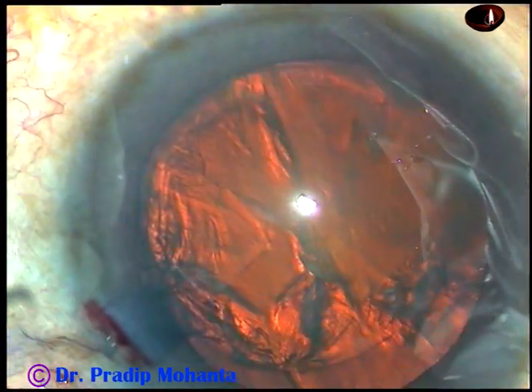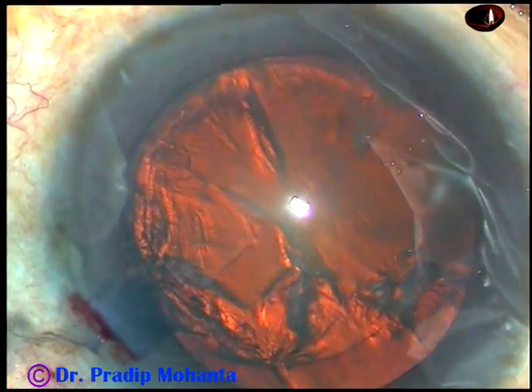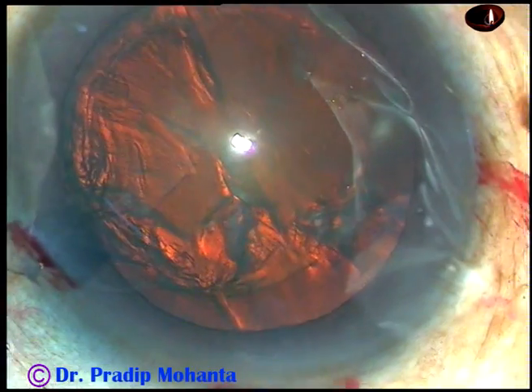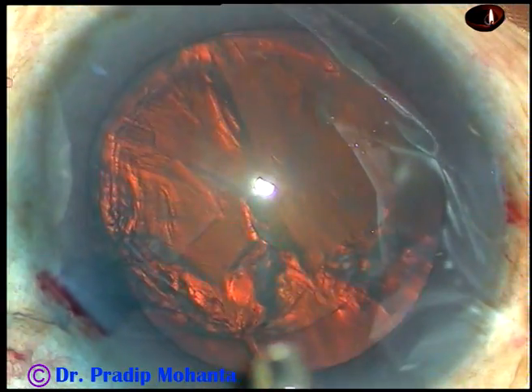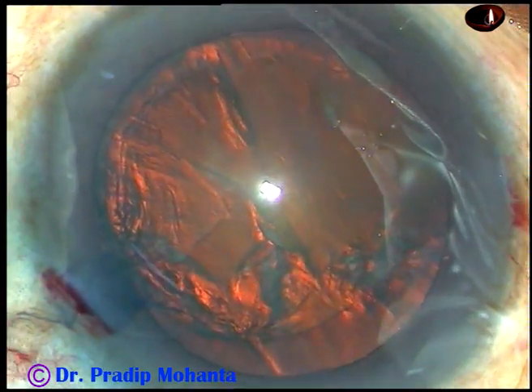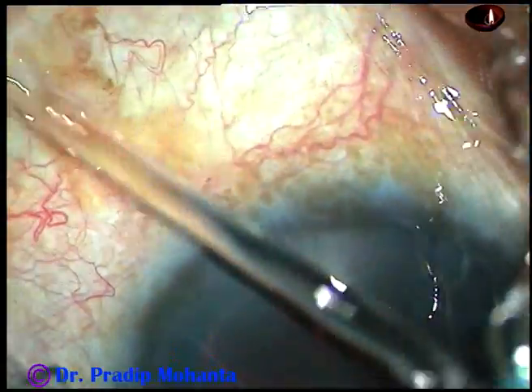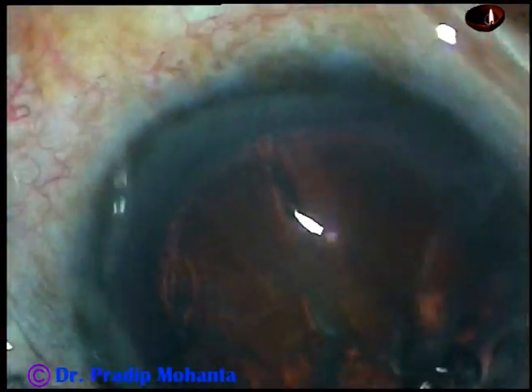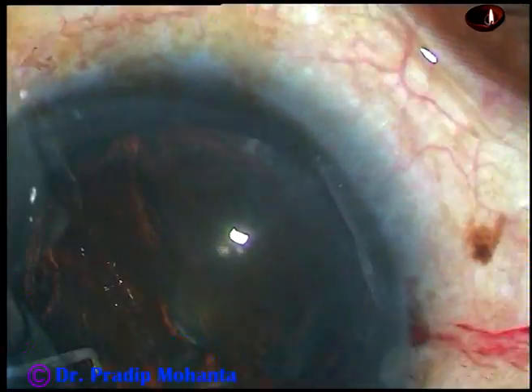By this time, all the initial steps including capsulorexis and hydro dissection have been done. And now, the handpiece is being introduced into the anterior chamber. Now, let us observe this part of the surgery very carefully.